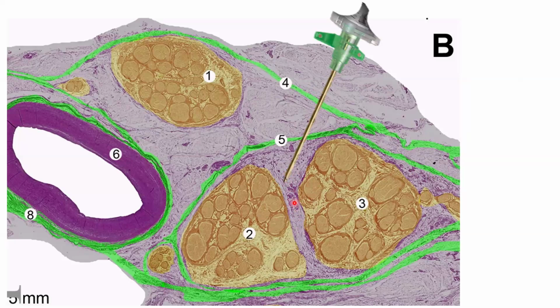But maybe with high resolution ultrasound nowadays, we can really distinguish with the current modalities. You can really distinguish between the tip placements in the innermost areas, like going beyond the circumneurium and trying to inject in between these two cords. You can really see those structures now, and probably you might inject in future very close to the cords, and it can be intraneural as well. But for now, when the students follow, it always has to be the paraneural sheath or the circumneurium, and it's never intraneural.